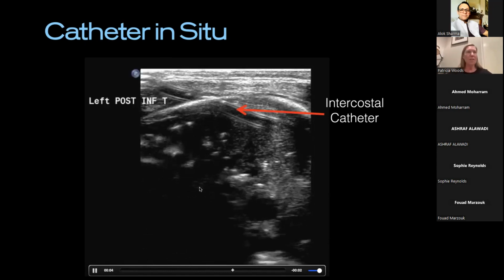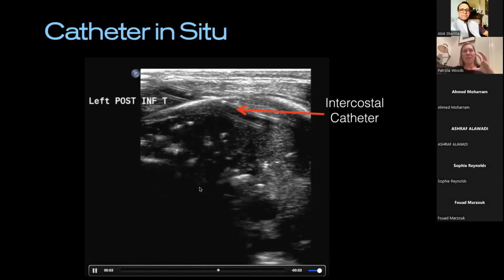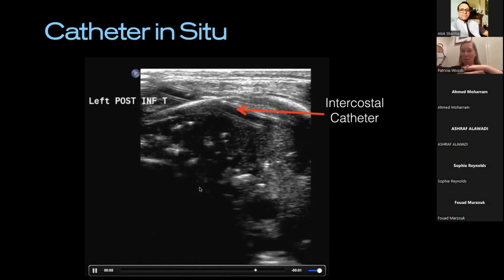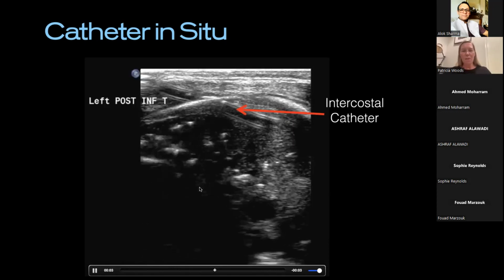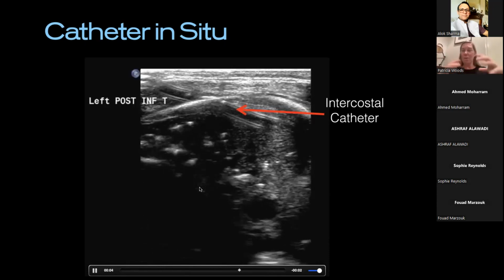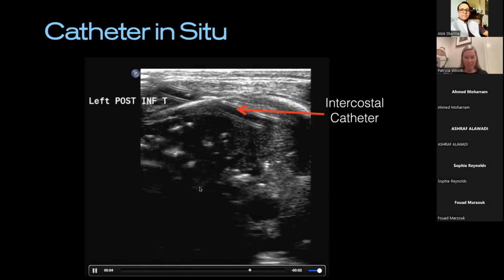So they're pretty excited about that when it comes to adult medicine, because you shouldn't really see that unless you've got really dense consolidated lung. I think if you go back to old medicine days of fremitus and all that sort of stuff, you're talking about transmission and conduction. But anyway, just aside, what I'm observing is big cardiac activity, a big solid chunk of hepatized lung, with air bronchograms, loss of pleural line, but you're just watching it move as one with the heart. Sorry, that was just a bit of a sideline.